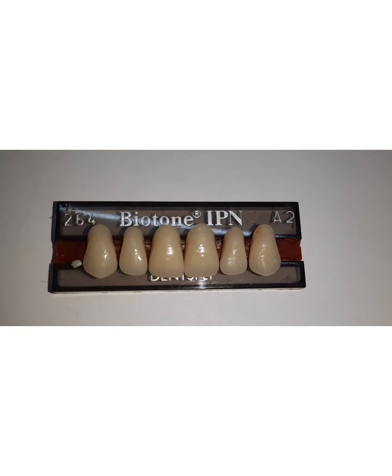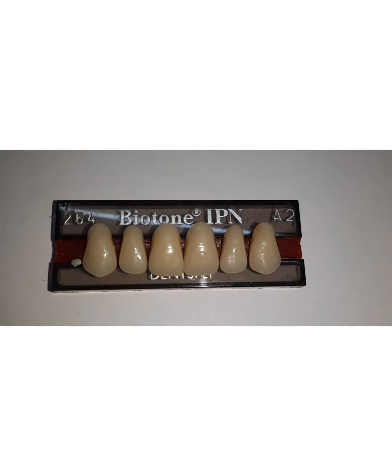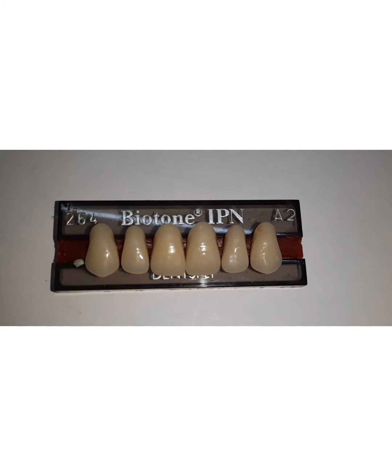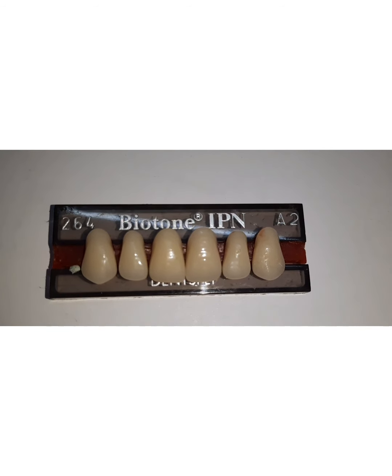However, the drawbacks of porcelain teeth are that they have poor fracture resistance. They are mechanically retained to acrylic denture bases with retentive pins. That is one big drawback of porcelain teeth. So we have to create these retention pins. We have to make diatoric holes on the surface of the porcelain teeth so that acrylic resin can mechanically lock into those holes, and they can be mechanically retained with the help of retention pins.